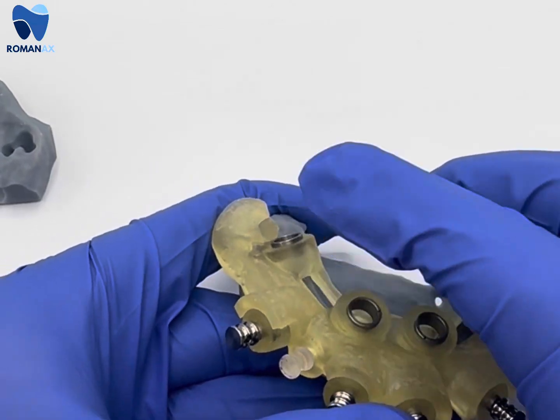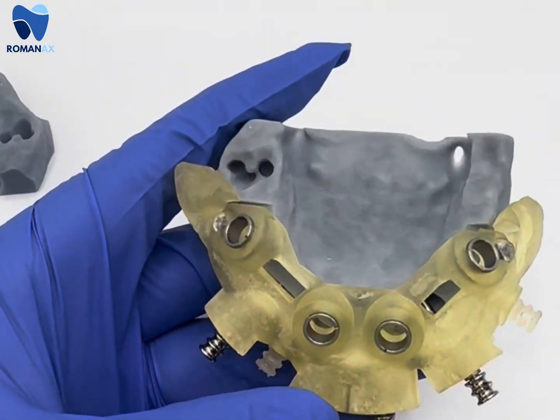The drill sequence follows the surgery kit, and that's it for this video.